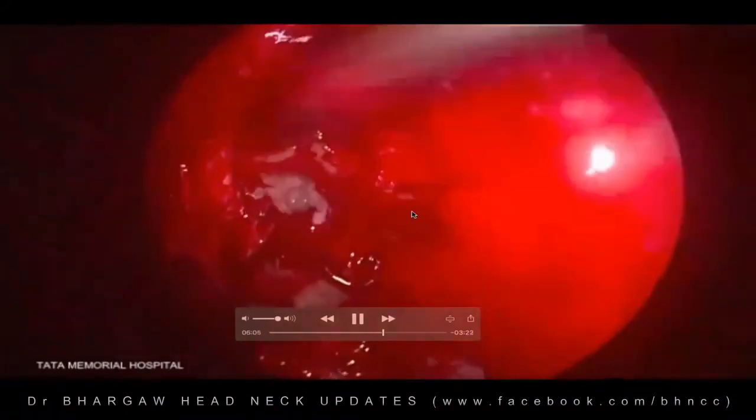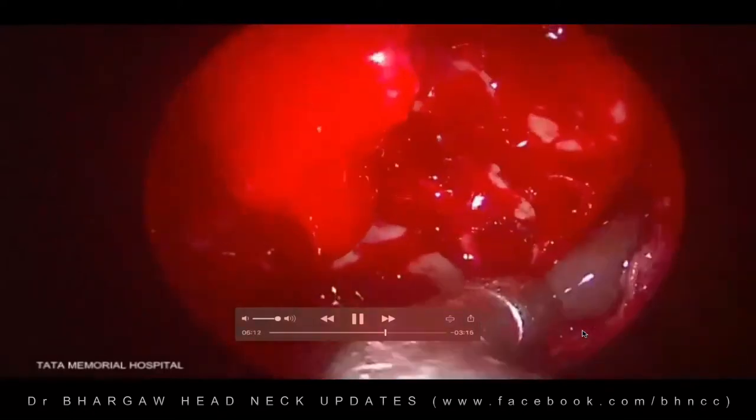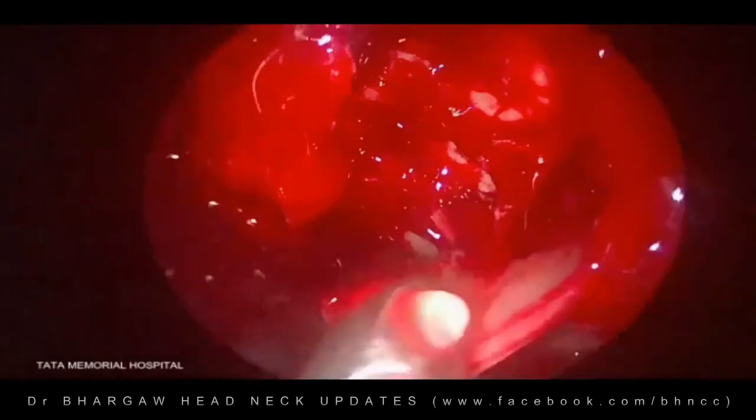There you go. So these are the ethmoidal cells. So here we are just doing an antrostomy.